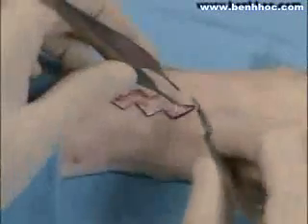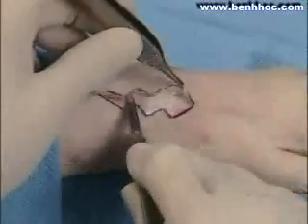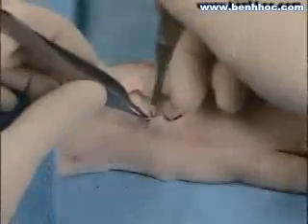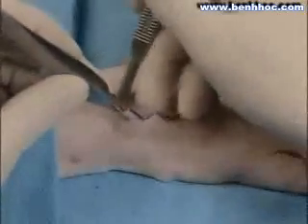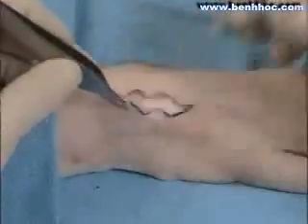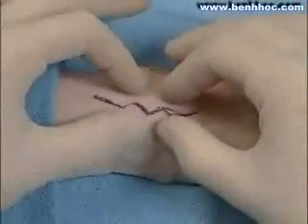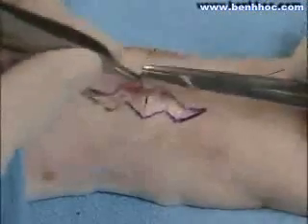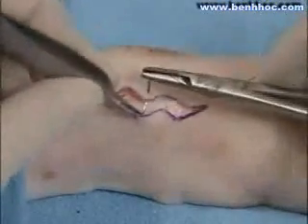Again, either a 15 blade or a dissection scissors may be used with the tips pointed upward so that you don't interfere with the underlying vasculature and then have to obtain hemostasis. Now finger pressure is used to make sure that it can be closed easily.